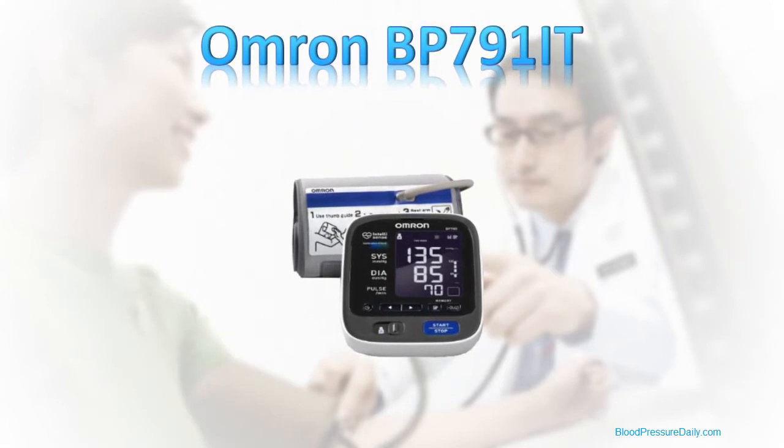Welcome to this review of the Omron BP-791IT blood pressure monitor. The Omron BP-791IT is one of the newest top-of-the-range home upper arm blood pressure monitors from Omron, and like all of Omron's 10-series monitors, it comes with 10 key benefits.